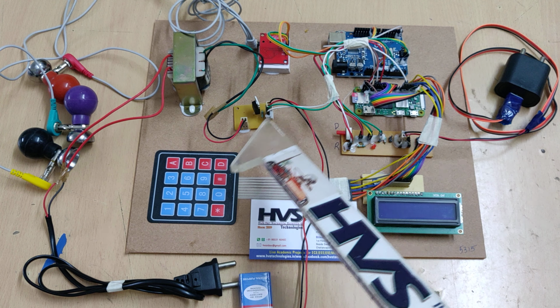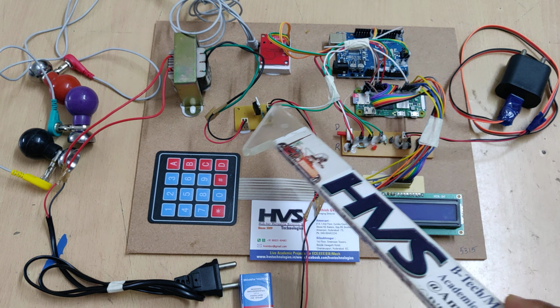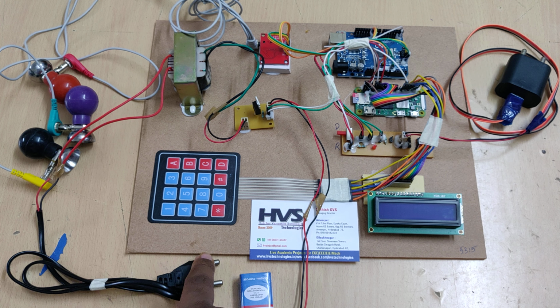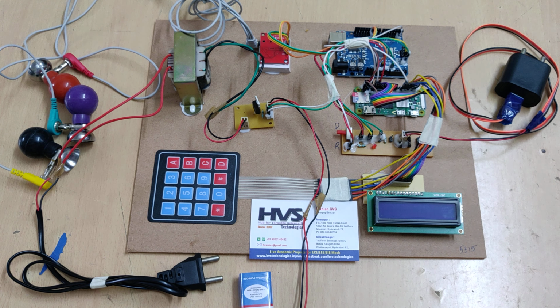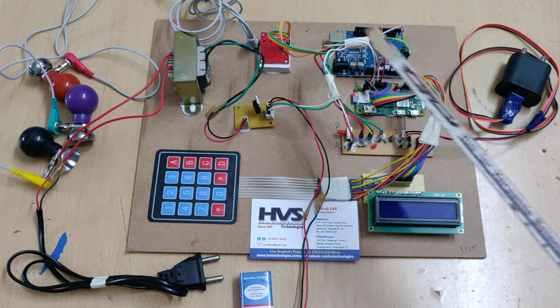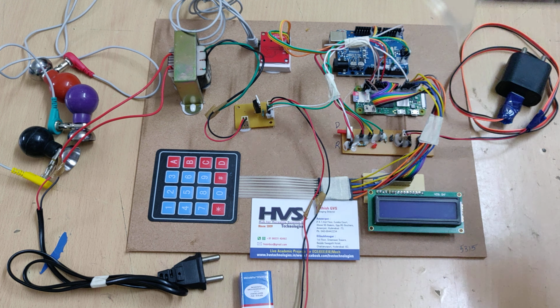Here the pacemaker working principle is that we generate the signals based on the disease. That signal will be amplified by using this step up transformer. From these 2 electrodes we are going to get the electrical signals for the stimulation purpose, which are sufficient for the heartbeat. Next, let us see the demonstration, and before the demonstration let me explain the connections.